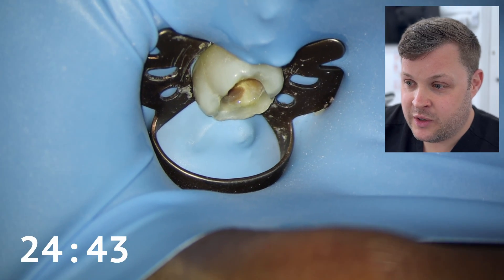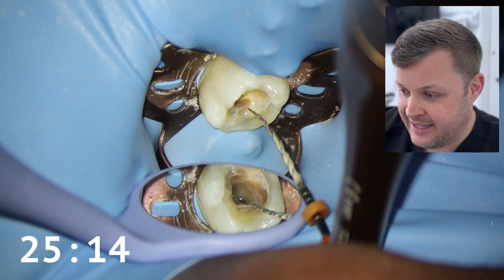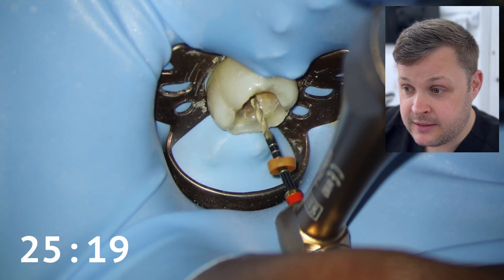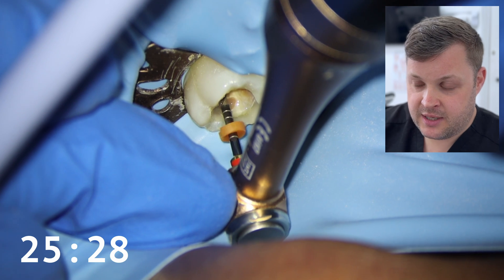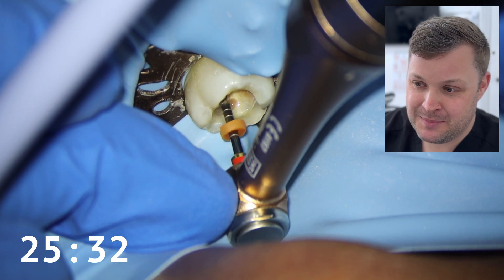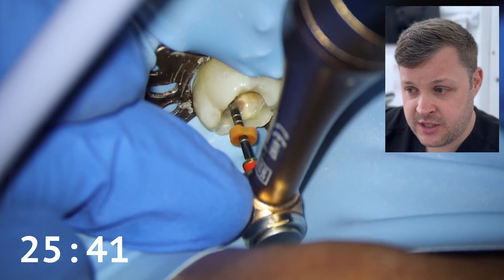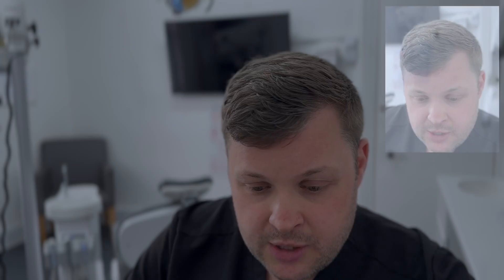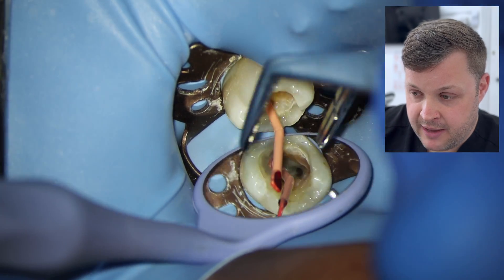Now we're going to use the 25 to length. I'm making a little bend again and putting the 25 back into T-mode — like watch-winding with a hand file. As it reaches near zero we press the button again, converting the motion to rotary, and it shapes the canal. And there you have it — the tooth is shaped. The reason we want to do this efficiently is that the most important thing in root canal is disinfection. We want to shape the canal space as quickly as possible, then spend loads and loads of time on disinfection.